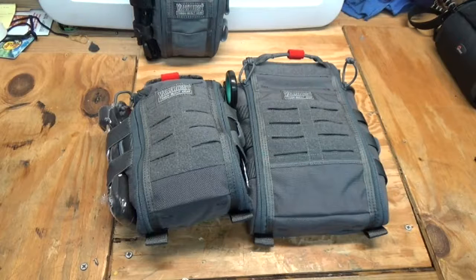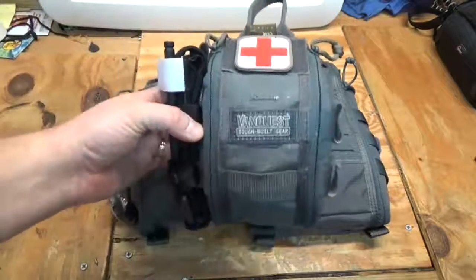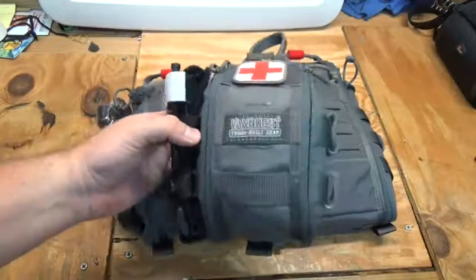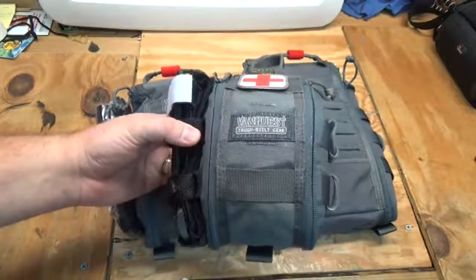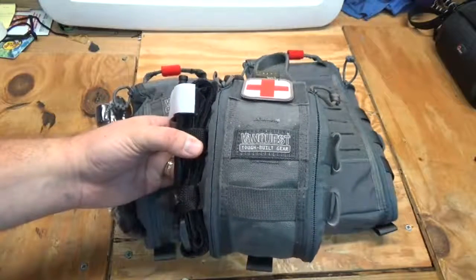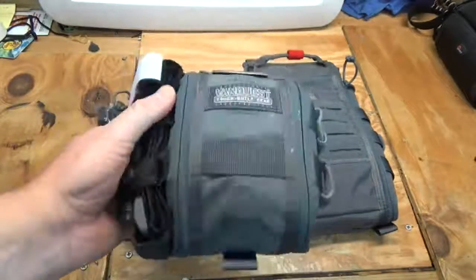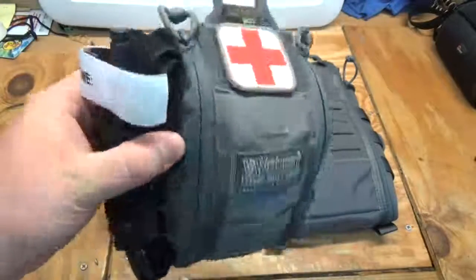Welcome back. In this video we go over some more trauma kits — more specifically the carriers that have been carrying my trauma kits. In a previous video I did a video on the VanQuest 4x6 fat pack and turned it into a personal trauma kit for myself. This is a kit I use out in the woods when it's just myself or maybe a couple of people going out for a day trip or overnight. I have a lot of capabilities with this little kit and I really like it.